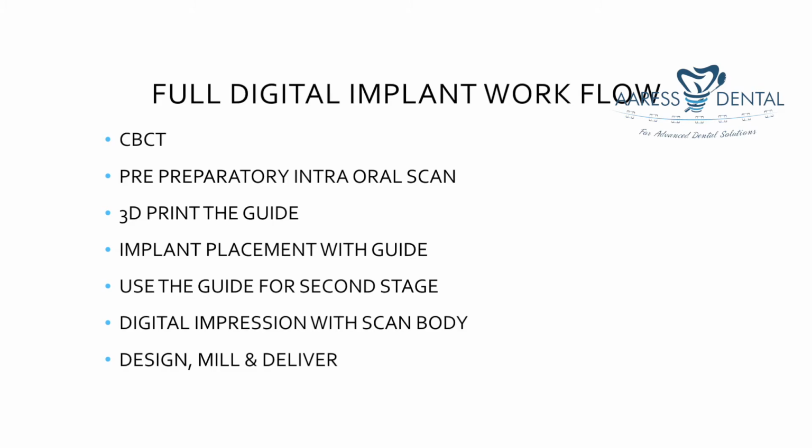Once the implant position is planned, it is transferred to a guide which is 3D printed. Then we do the surgery with the guide. We can use the guide for opening in the second stage. Once the second stage is done, we take a digital impression with a scan body. Once the digital impression is done, we do the designing, milling, and delivery processes.